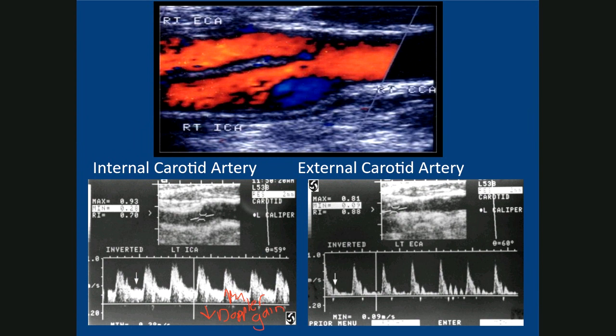Okay, because what we want to have is a clean window. Because if this isn't clean, that may indicate to the radiologist who's reading this study that this person has turbulent flow. Clearly we can see that their gain is too high here in the grayscale display, and the gain is too high in the Doppler display. So both the grayscale, the TGCs, and the gain have to go down. Okay, so the gain should go down here, and the Doppler gain needs to go down.